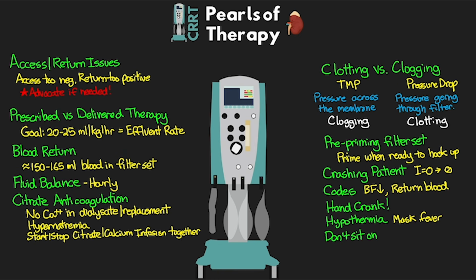Also, don't sit on bag changes or effluent bag empties. In this state here, the blood pump is still running, but the therapy is not. And the same goes for clearing alarms. The yellow alarm could mean that therapy is not running for your patient.